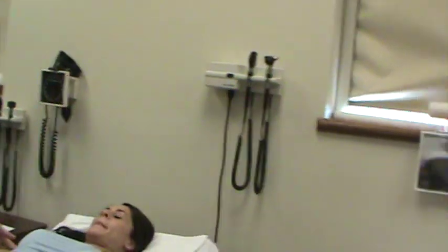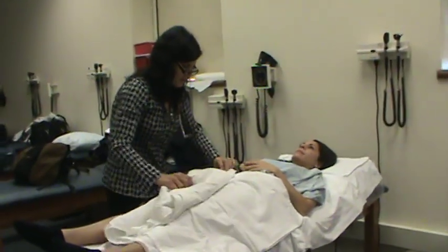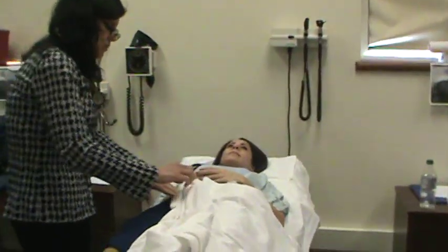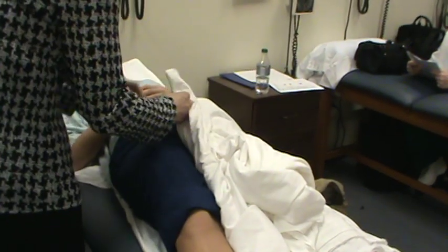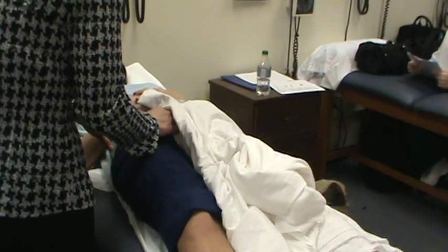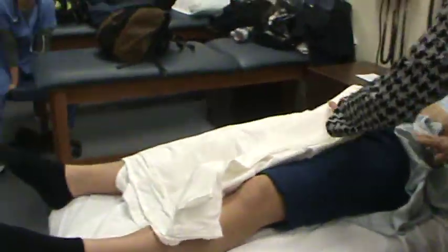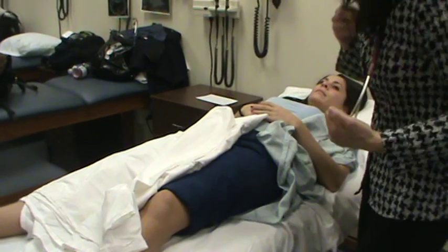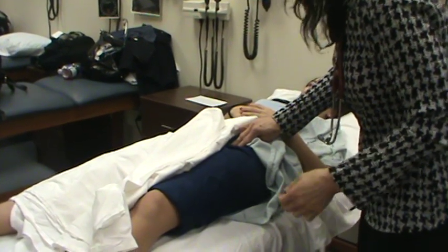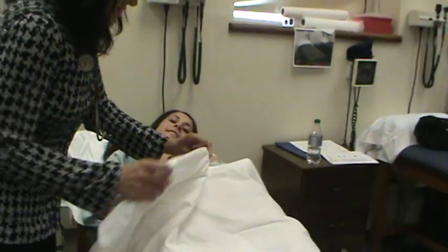Now we're going to take a look at your peripheral vascular system. The first thing I'm going to do is go down to the femoral artery — right about halfway between the ASIS and where the pubic tubercle would be. Using the bell of my stethoscope, I'm going to listen for the femoral artery. Then I'm going to go around to the other side and do the same thing. Once I've auscultated, now I can palpate — I'm going to feel right in that area. You have a lovely femoral artery. And do the same thing on this side.